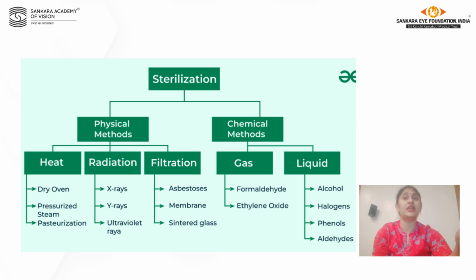Under the physical method, we have heat, radiation, and filtration methods, and under the chemical method, gas and liquid methods. So ethylene oxide is one form of the gaseous chemical method.